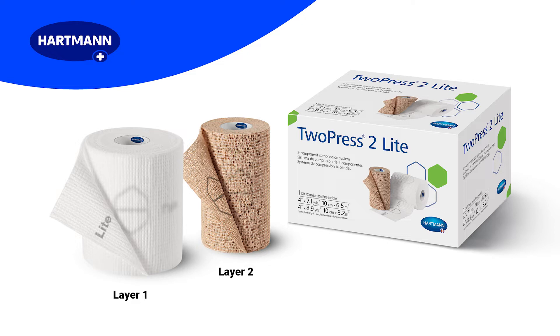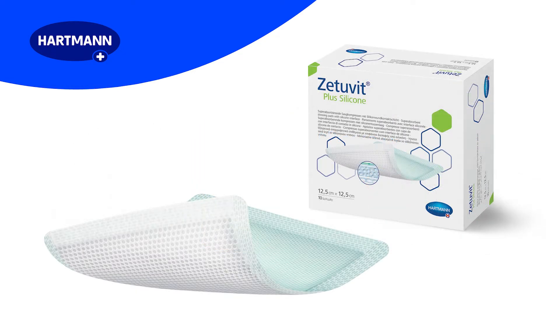Prior to application, examine the leg to identify bony prominences and potential pressure points and pad those with the white padding bandage. If a wound is present, clean the wound and apply a suitable wound dressing. In this demonstration, the wound has been covered by Zetuvit Plus silicone, which would be an excellent choice for a venous leg ulcer.